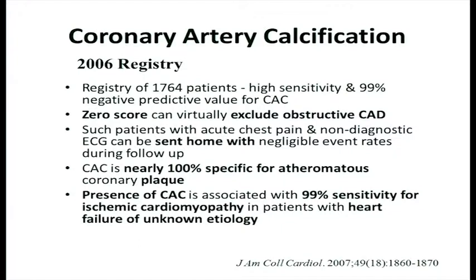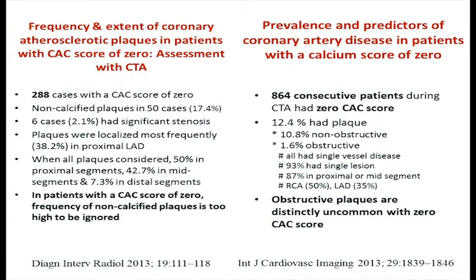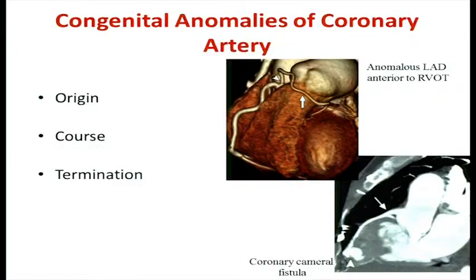And if calcium is present in the coronary arteries, then it is 99% sensitive for ischemic cardiomyopathy in patients with heart failure who have come with unknown etiology. But let's not forget that even if there is a calcium score of 0, there may still be non-calcified plaques, but obstructive plaques are distinctly uncommon with a 0 calcium score.